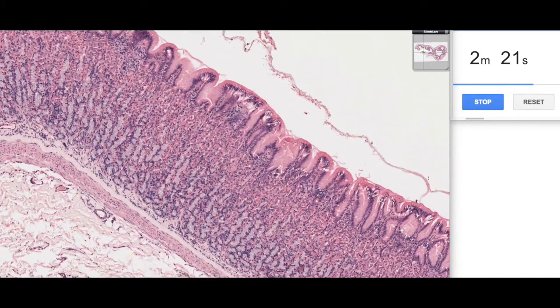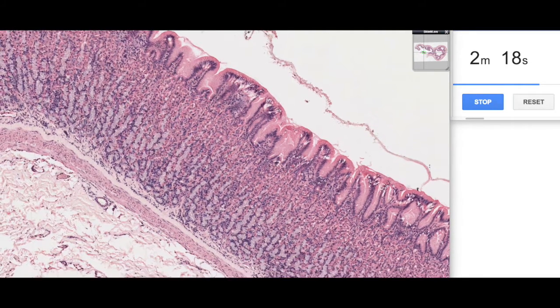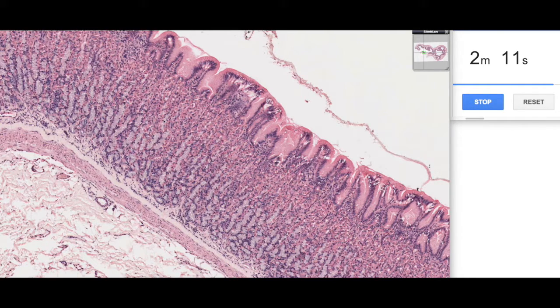Emptying into each of these gastric pits are several gastric glands. All of this tissue here is glandular tissue. It's very difficult to see the lamina propria loose connective tissue in between, though you can sort of make out some of these elongated cells here.